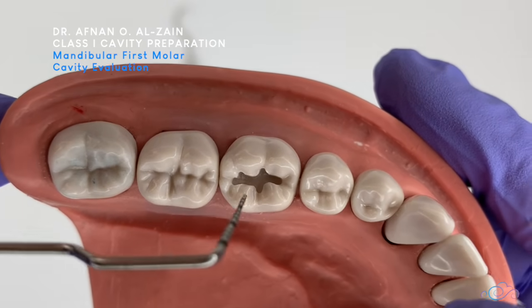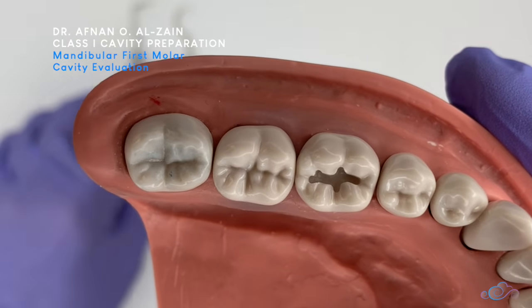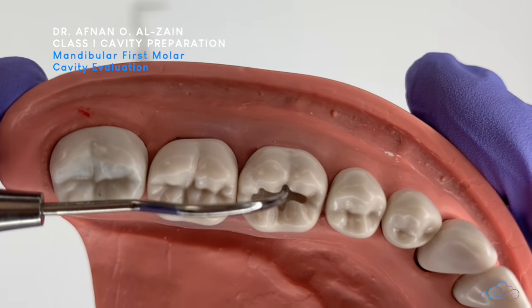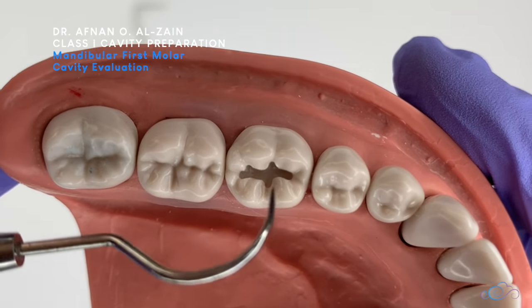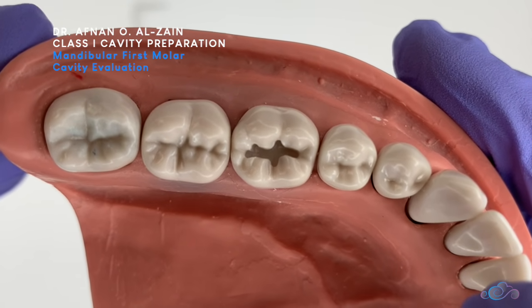After that, we can see that the extension is good — entering all the grooves. Check the smoothness of the cavity and confirm that everything is smooth. There is no catch in the floor or in the walls, and we have rounded line angles. This is the final shape for a cavity preparation for composite.